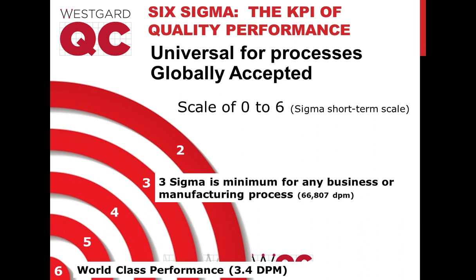Another great question. I think if anything you get out of today's presentation, it's that there is a high degree of variability, not only from instrument to instrument, but from test to test on the sigma metric. It's particularly challenging for hematology because you make all the same measurements at the same time, but you will find for some counts, some parameters, some indexes, the sigma is not the same. So across basically any instrument, there is no single sigma metric that covers the whole instrument or all of the different tests. You will have some parameters at 6 sigma and other parameters at 3 sigma.